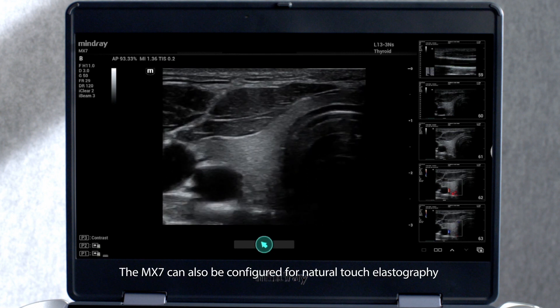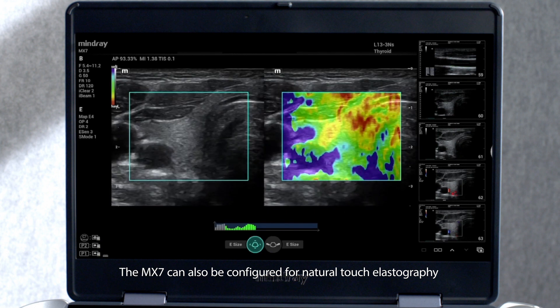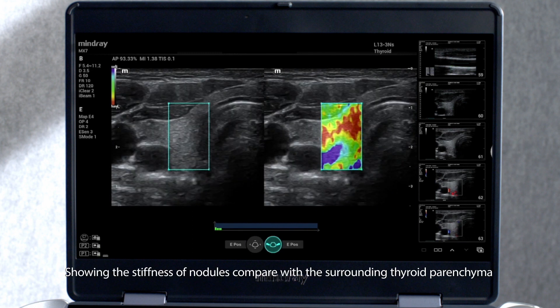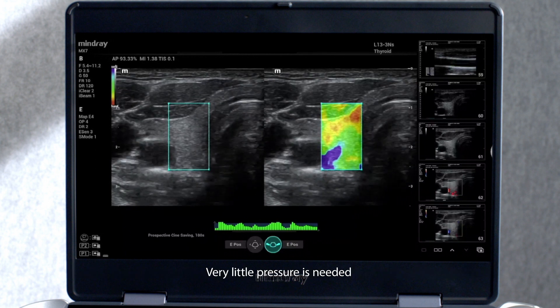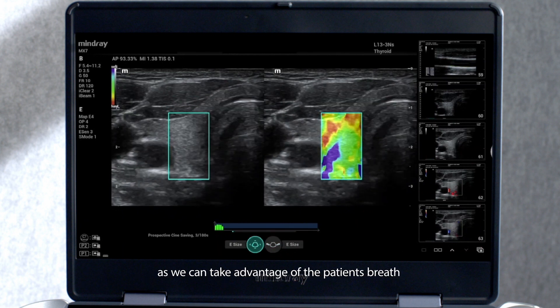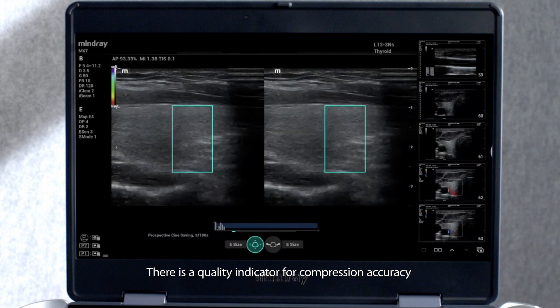The MX-7 can also be configured for natural touch elastography, showing the stiffness of nodules compared with the surrounding thyroid parenchyma. Very little pressure is needed, as we can take advantage of the patient's breath. There is a quality indicator for compression accuracy.